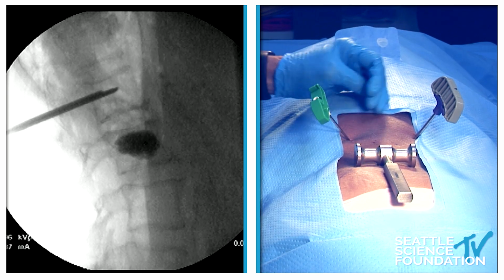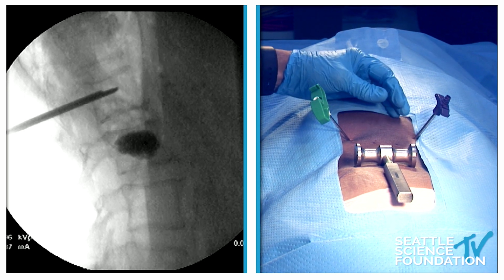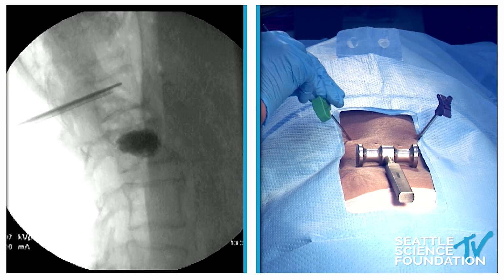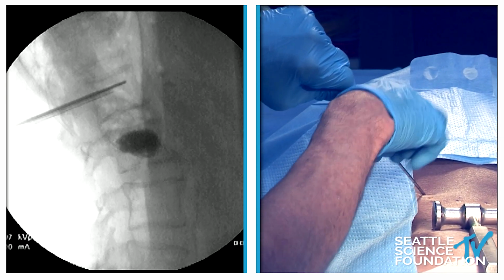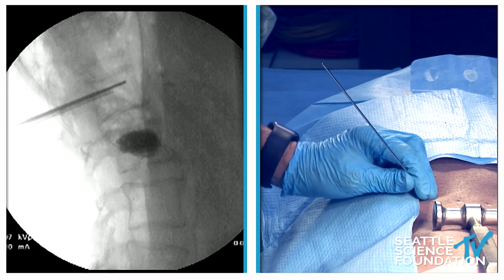So right at this point in time, I'm going to take the stylet out and put the K-wire in. I'm going to do this on one side so you can get the full view of this. So this will come in and set right there. And always twist as you pull out. This bone doesn't like shear. It's very resistant to compression and distraction.